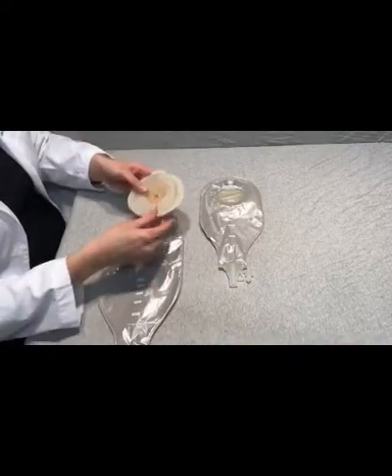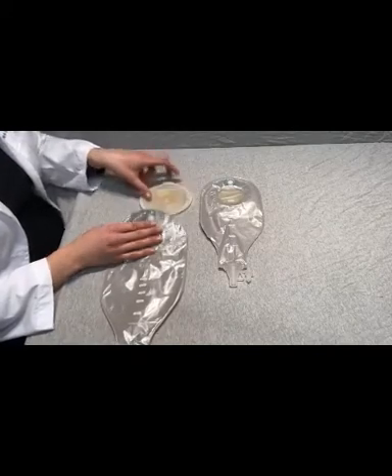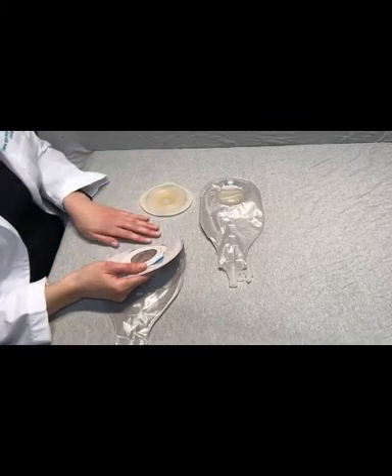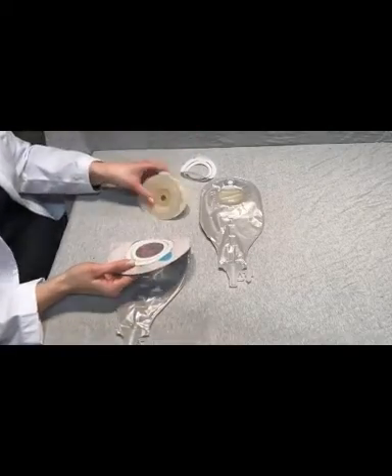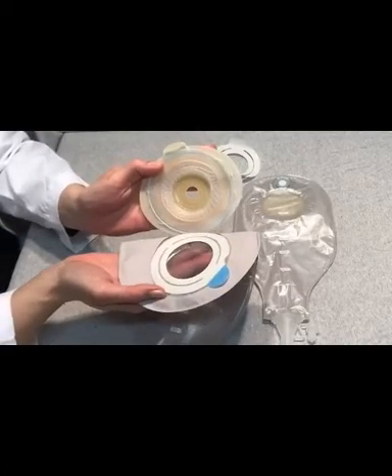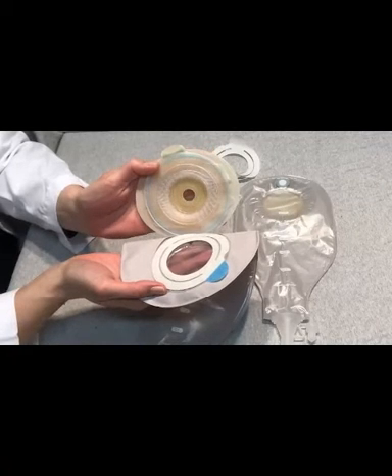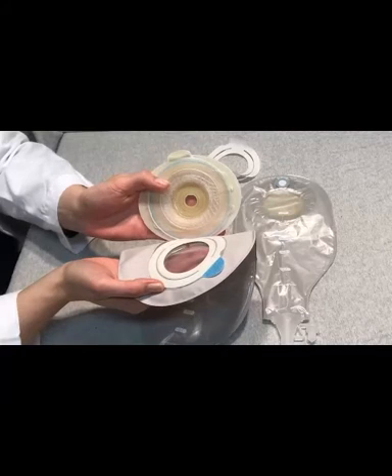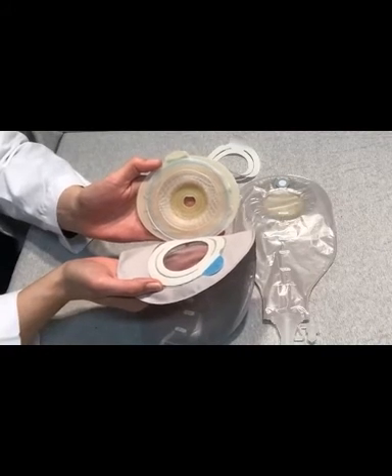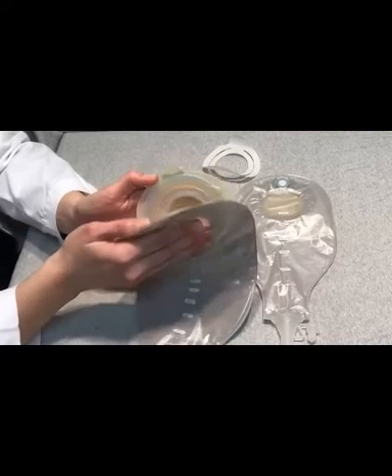As far as applying the pouch to this flex barrier, after this is completely prepared and cut out to fit the patient, I'm going to peel off the backing here. You're going to line up the bottom of this pouch with the circular blue line on the landing zone. This landing zone has to be clean and dry prior to applying and doing this step. And they're going to apply.